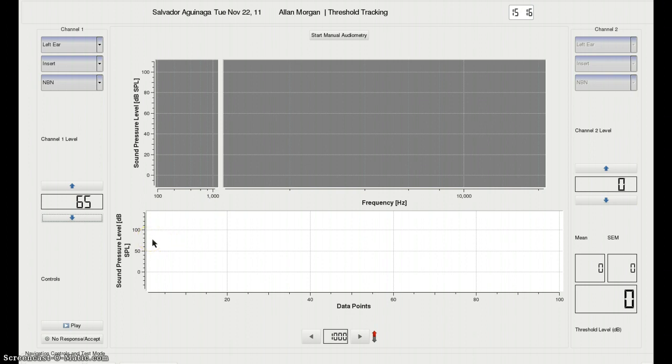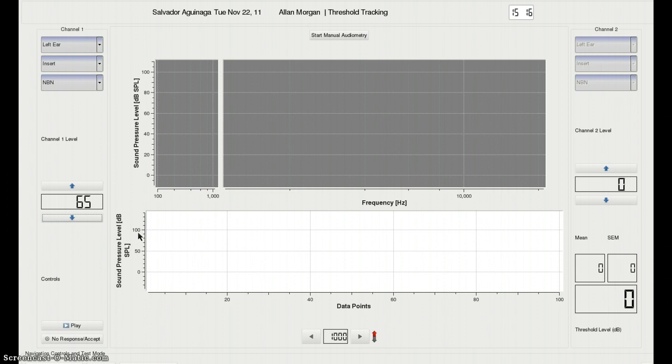once a couple of reversals have happened, you'll see this range will zoom in, so that you'll only be looking at a 20 dB range, so it will be easier to track the changes in the plots.